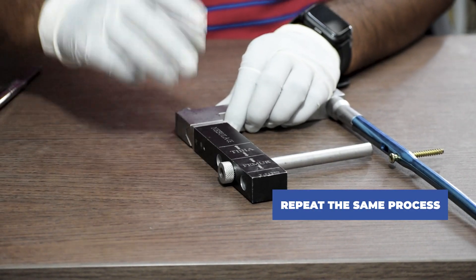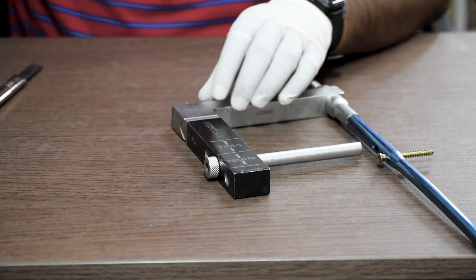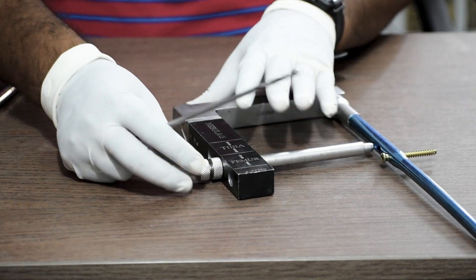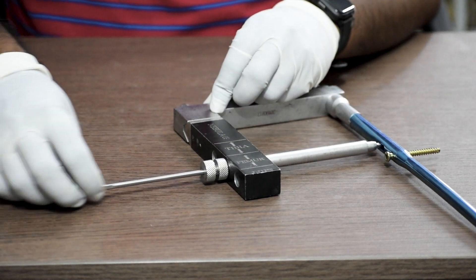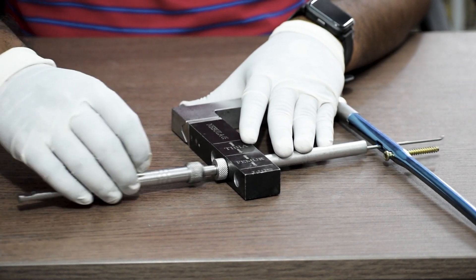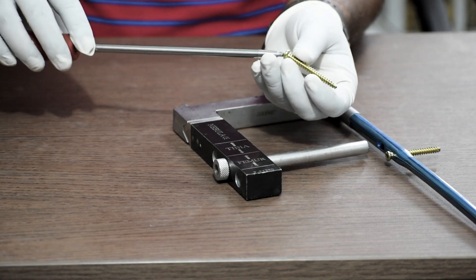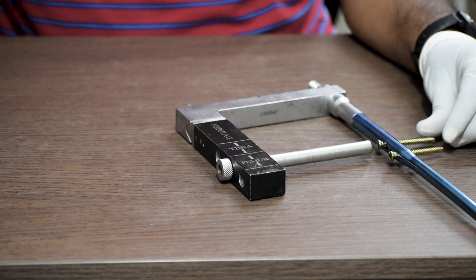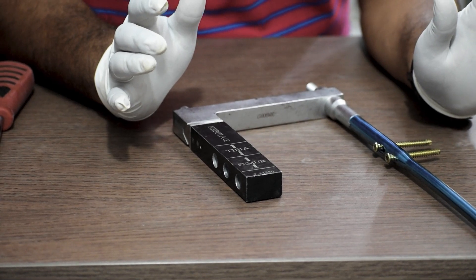We repeat the same process for the other hole as well. Thus, we complete the locking of the proximal end of the femur nail.